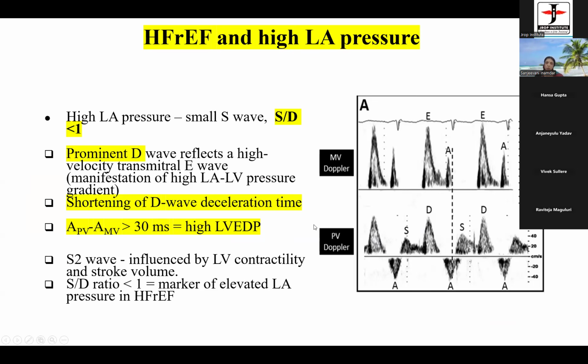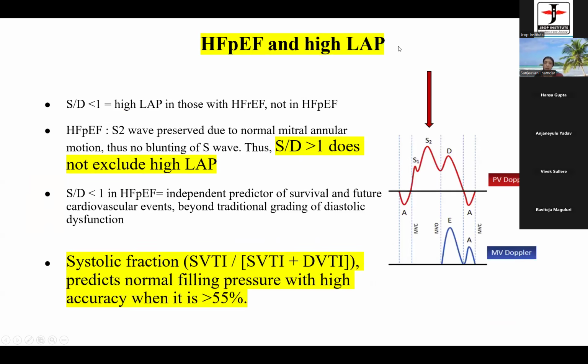But when it comes to HFpEF and high LAP, if the S/D is normal, that doesn't mean that there is no high LAP.